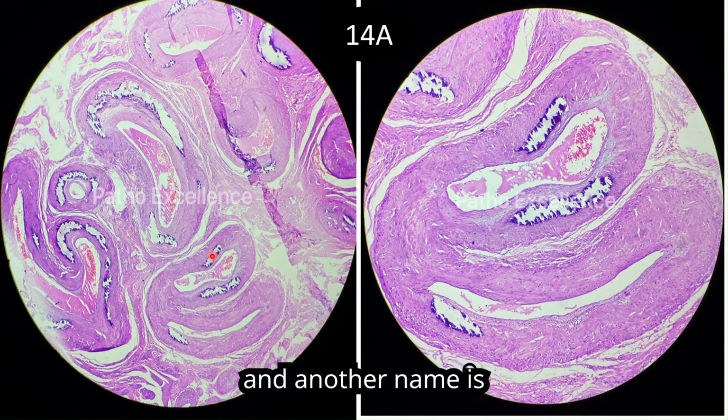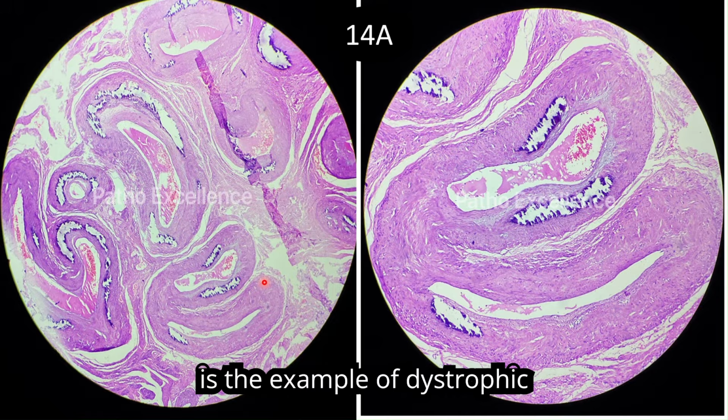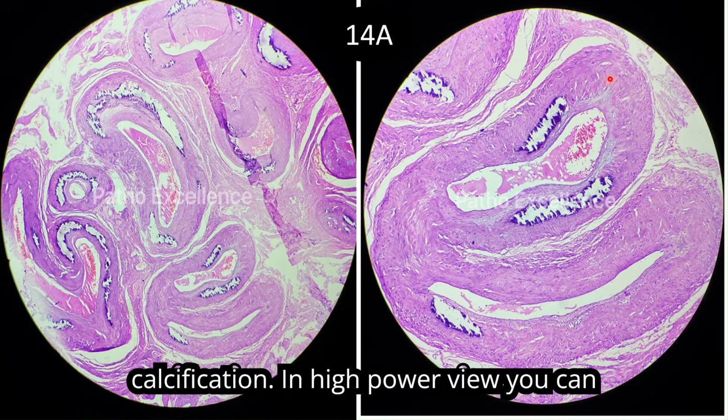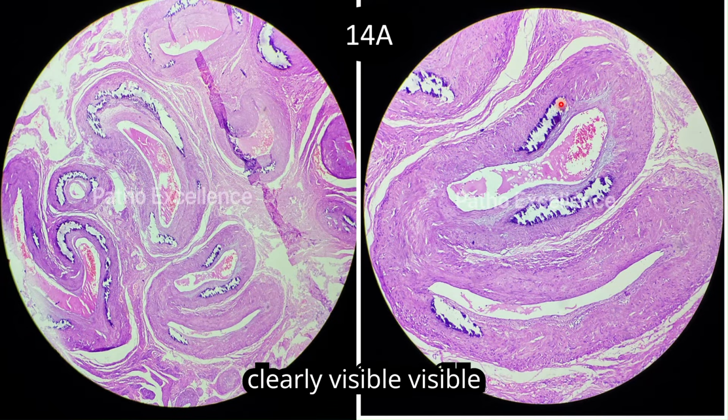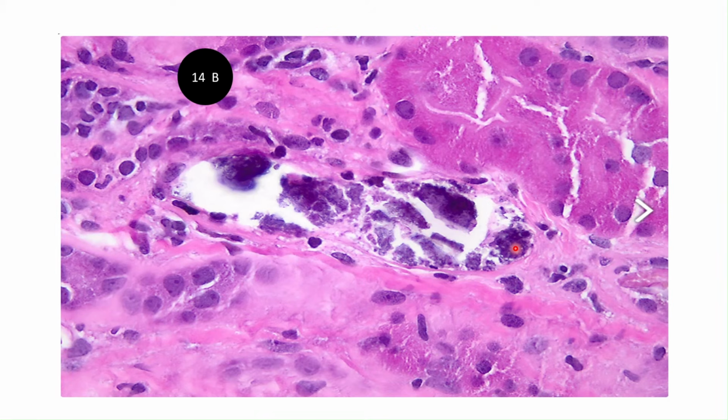And another name is Monckeberg calcification. Right? So this is the example of dystrophic calcification. In high power view, you can clearly see deposition of calcification in the media.